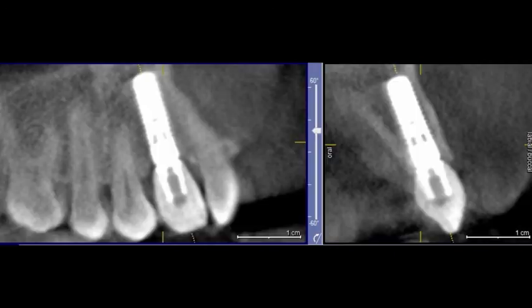We also took a post-op CT scan here after 18 months. This is the 3D view, and after 18 months we can see how nicely that bone graft that we did apically has blended in, and the patient now has a nice, at least 2 millimeters thick, facial plate in those areas surrounding the implant completely. And this implant restoration should serve her really, really well for a very, very long time because this is a very stable result now, with this nice bone surrounding the implant, a stable implant, a nice restoration. So altogether, a very nice biologic, functional, and aesthetic outcome.